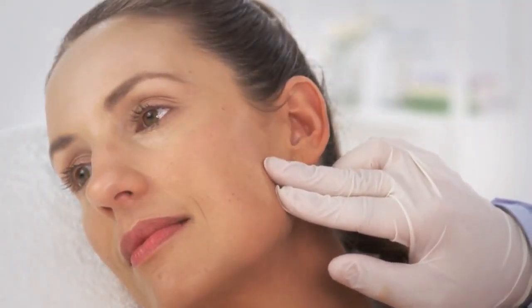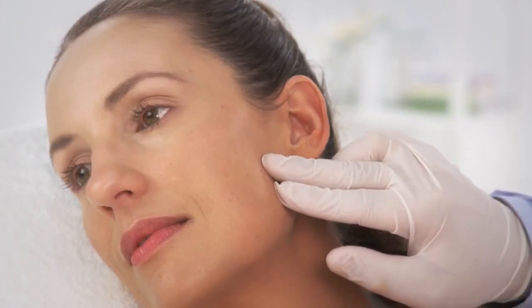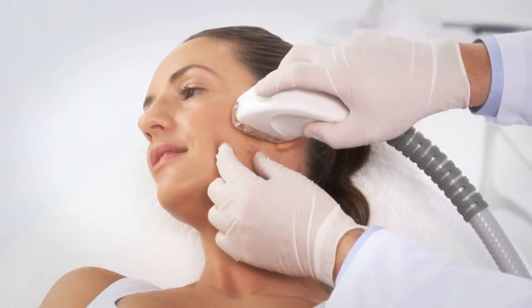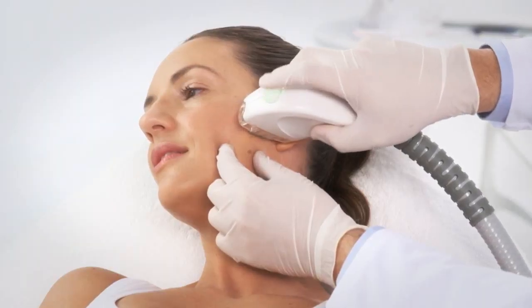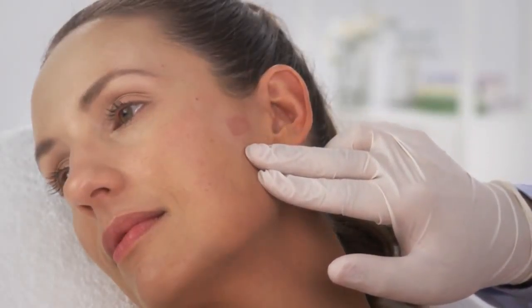Perform a treatment test spot on the border of the intended treatment area, preferably non-visible, in order to assess the optimal parameters for the patient. With the fingers of your free hand, gently stretch the skin around the treatment spot. Position the FSR handpiece on the skin. Push and hold the trigger on the handpiece. An audible clicking signal and illuminating LED indicates RF emission on. Release the trigger only after you hear the sound that indicates that the pulse was completed. Evaluate the test spot at least 5 minutes after the pulse was delivered.